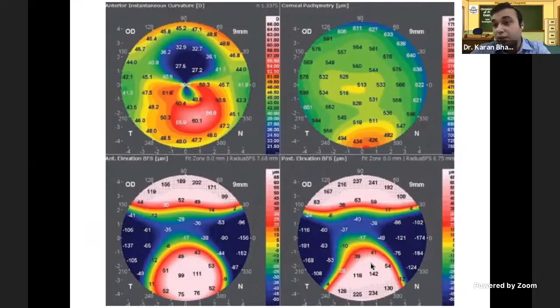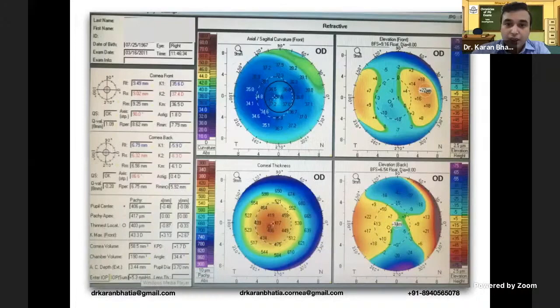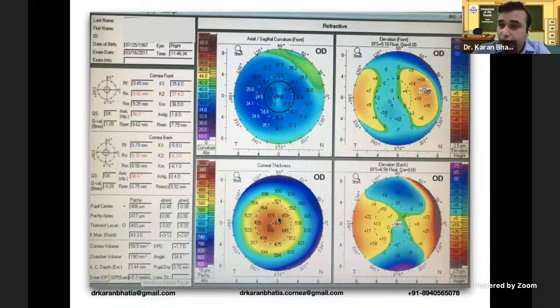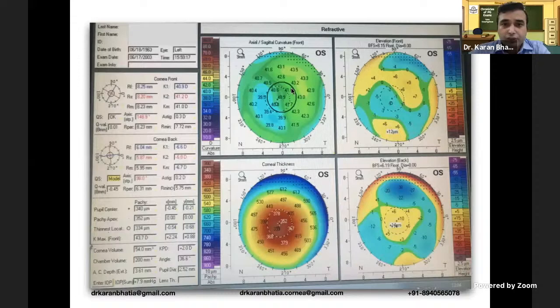Another picture shows a very steep cornea with generalized thinning — indicative of keratoglobus. When you see predominantly blue colors and an absolutely flat cornea that is also thin, this means it is a post-refractive surgery case — either post-PRK or post-LASIK; you cannot differentiate the two on Pentacam alone. In another post-LASIK case, there is a slightly decentered ablation shown as a greenish-blue area.